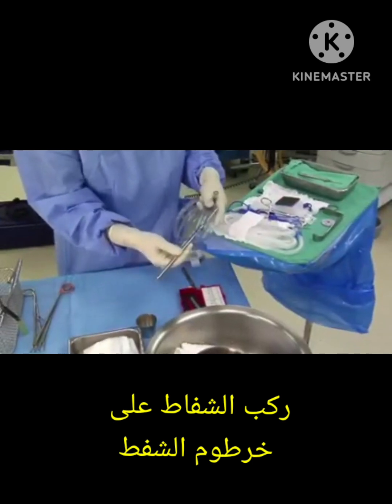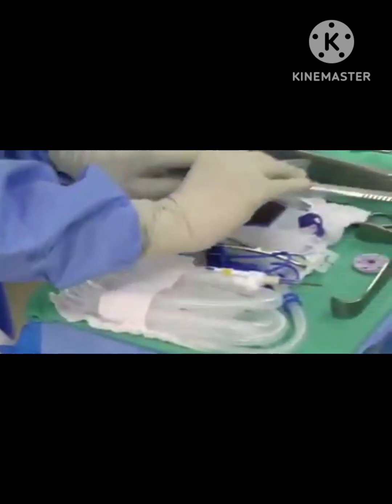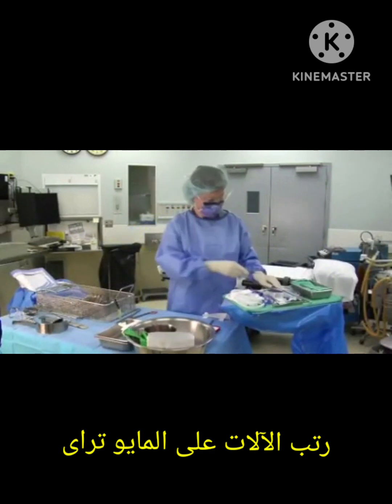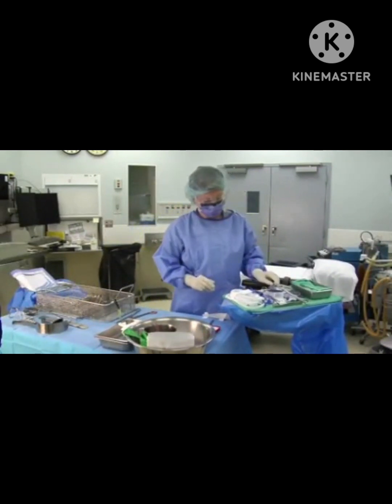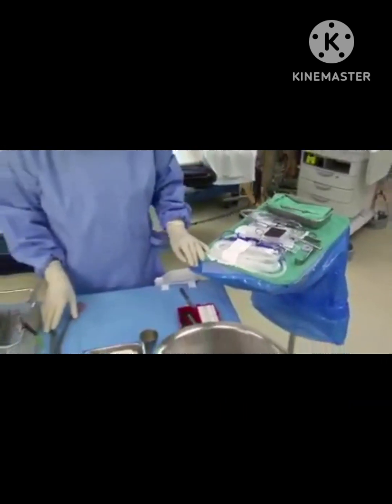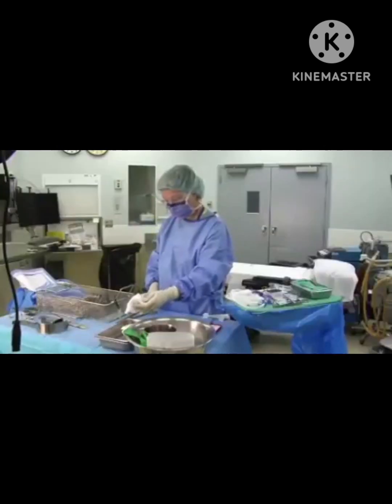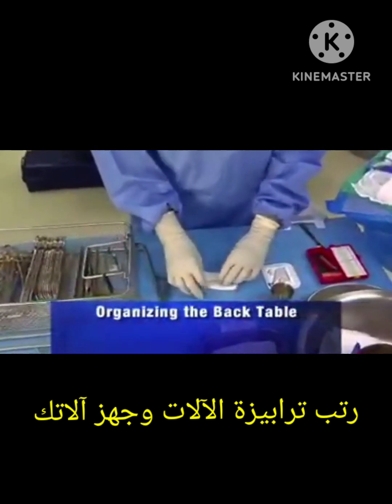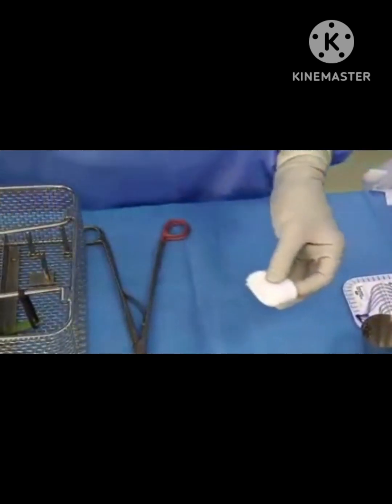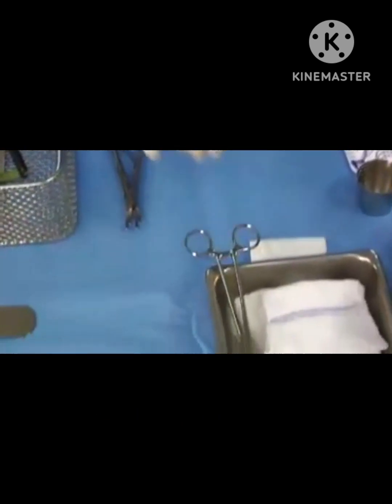Attach the ESU tip cleaner to the plastic isolator for the handpiece. Connect the suction handpiece to the tubing and put them on the mayo tray. If required, provide towel clips to attach these items to the drapes. Do not let items hang over the edge of the mayo tray — the tray should be neat and organized so that team members can access all items quickly, safely, and efficiently.